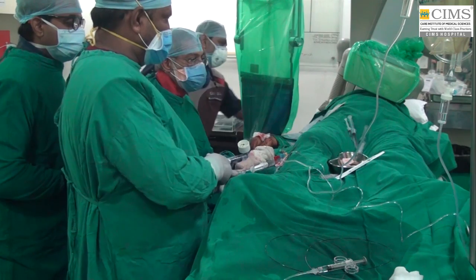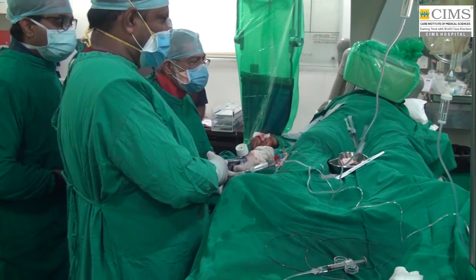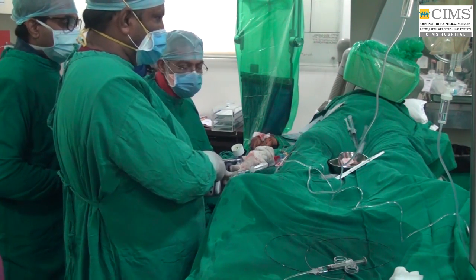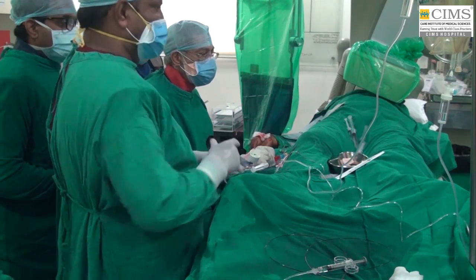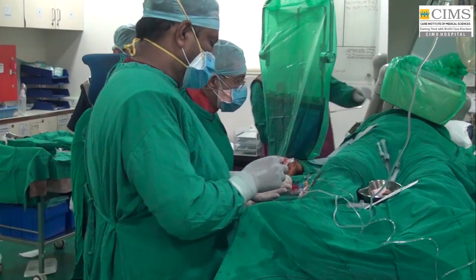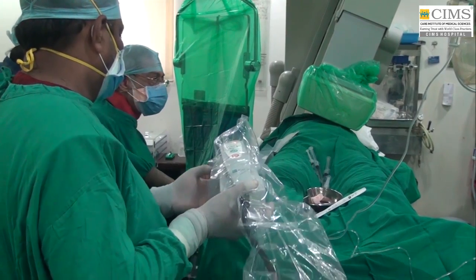Like again in this case, going ahead with a 3.5 balloon and post-expanding to a higher pressure can only be achieved with the confidence of OCT, and making sure that the edge dissections, if they are large and sometimes not seen on the angiography, are tagged properly with another stent.